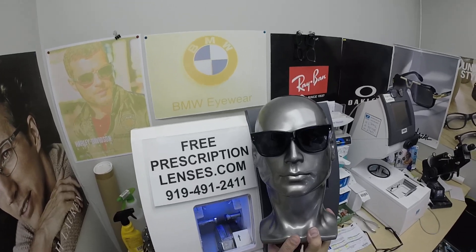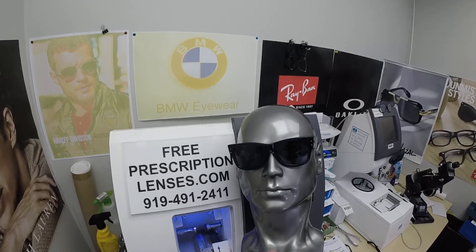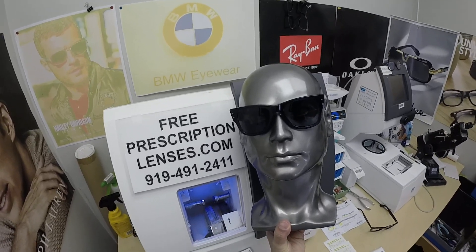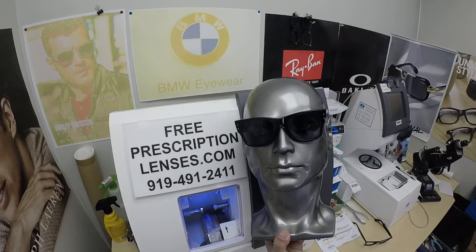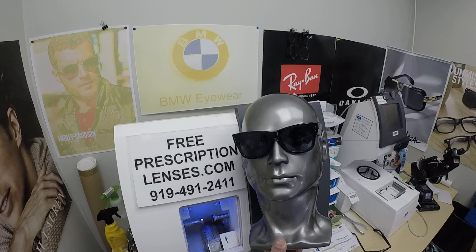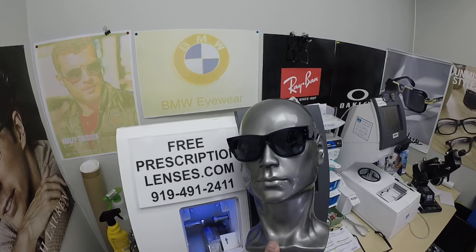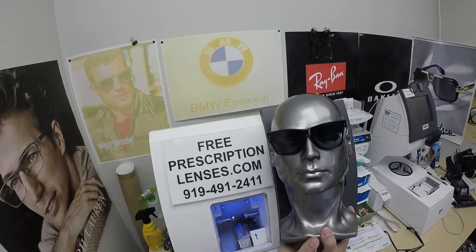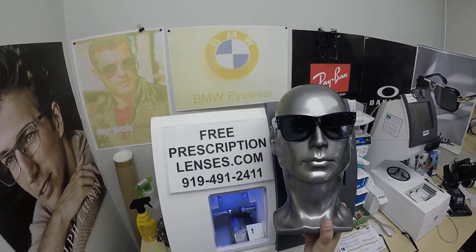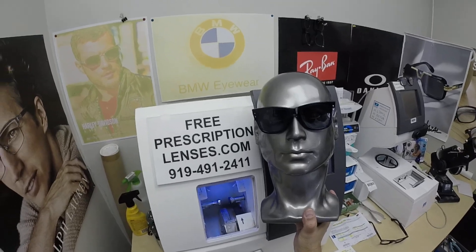The Zeiss Blue Protect has a purplish hue to it. If you get the Platinum, Zeiss automatically adds their new Blue Guard, which is a clear blue light protection, and then they put the bluish anti-glare coating on top of that. Zeiss Duravision Platinum has the least amount of reflection in any lighting at any angle, where the Blue Protect has a purplish hue. Women don't seem to mind, but guys like that added feature of the Platinum, and it has the Blue Guard built in already.